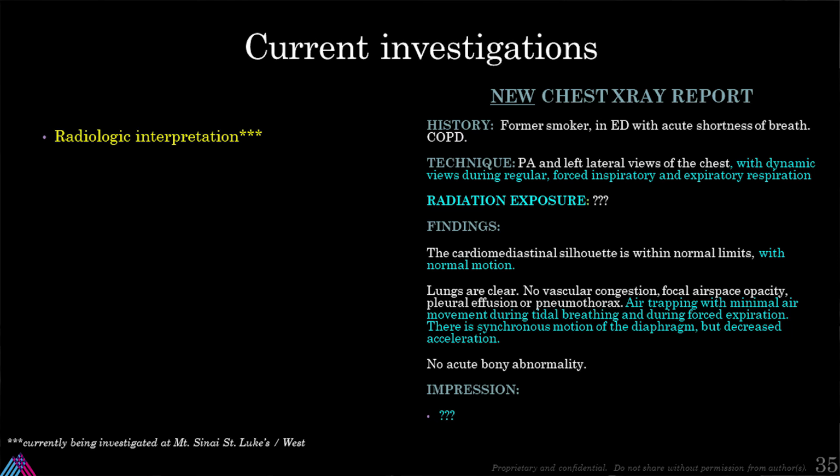Is there air trapping? Is there synchronous motion of the diaphragms? Are there other areas like fibrosis, like areas of bullous disease that would look different now? And is it regional? I think that's something I'm not mentioning here on this report, but highlighting back, again, the global disease of lungs versus regional disease of lungs.